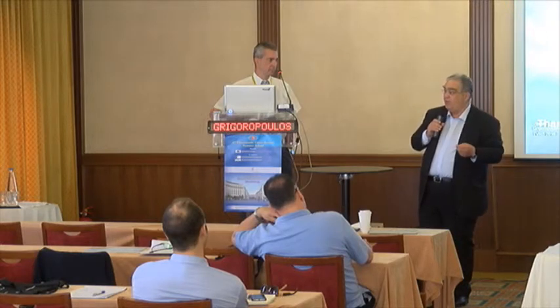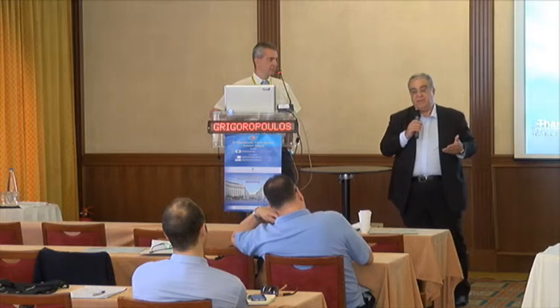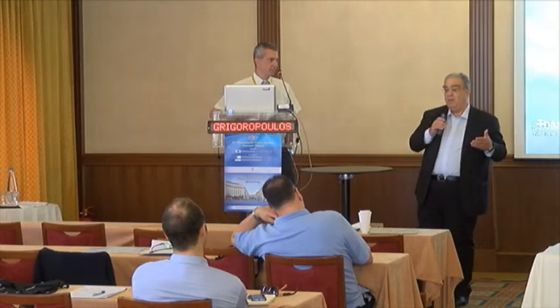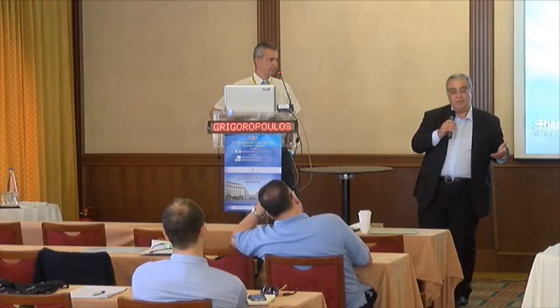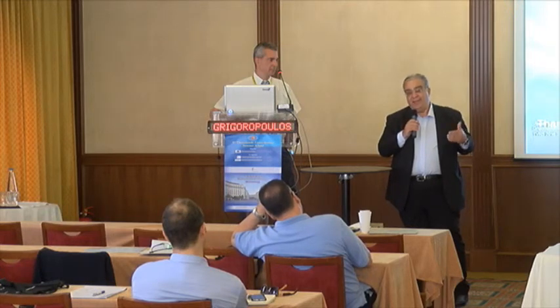And also, if you try to remove things from the eye, the first impression of how the holes were closing was made by a Japanese colleague at the Vail meeting in Colorado that we went to last year. He said that he was doing surgical OCT and found out that if the hole is not closing in 24 hours, it will almost never close. So we know now that with surgical OCT, if you don't make the closure quickly in the same 24 hours, it's very difficult to close the hole, and we know which way to go. So this is the future. You're watching it, and thank you very much.